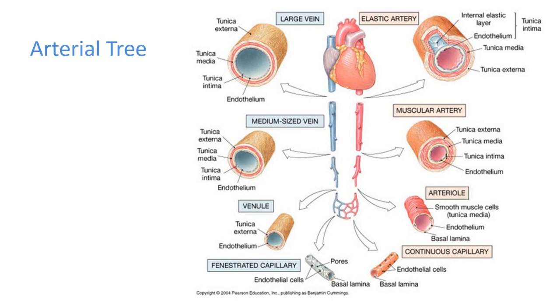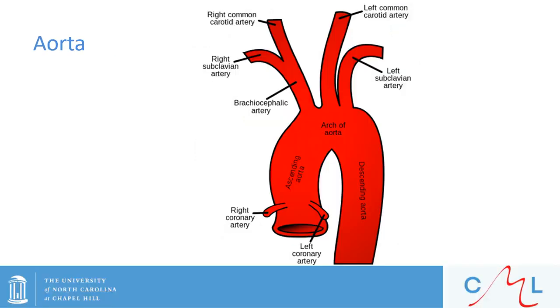Now, I showed you before the measurement of carotid to femoral pulse wave velocity. This measurement is of particular interest because it is thought to reflect the stiffness of the aorta. The aorta, which is the big tube coming off the left ventricle of the heart, is important because this artery presents the major opposition to the work of the heart.